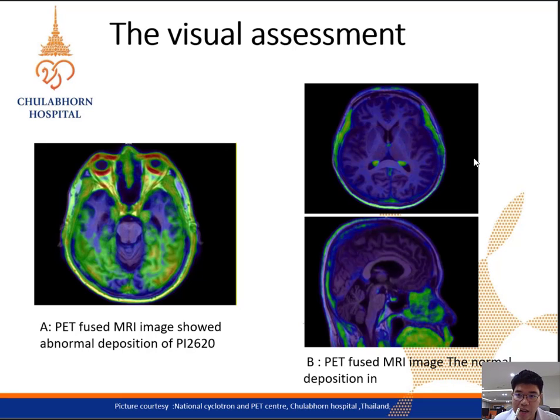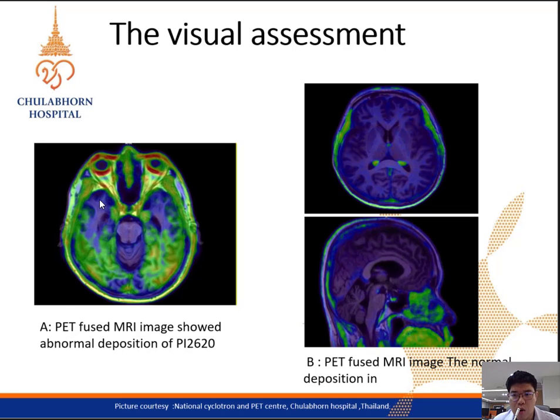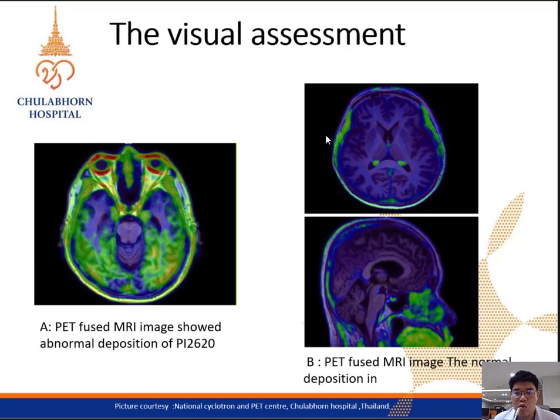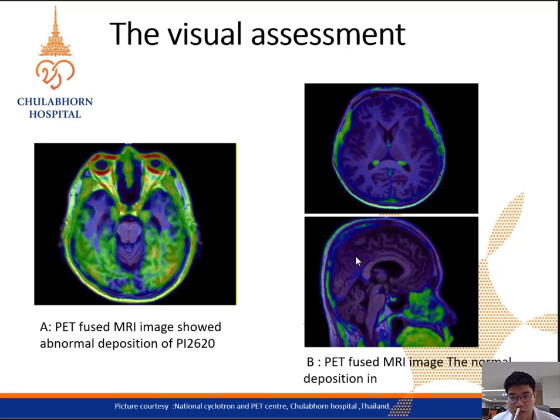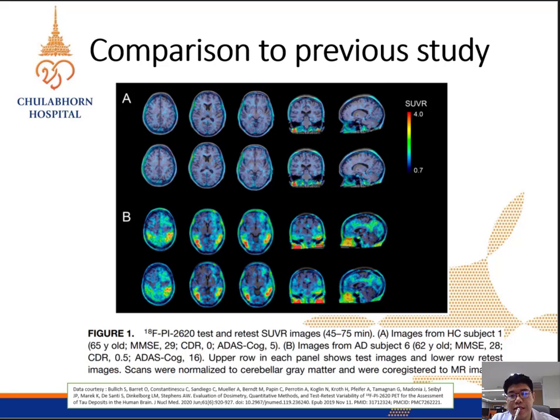The graph shows the overall picture of SUVR values. All observed regions for the MCI and CN groups are below 1.2. In the AD group, the SUVR in significant brain regions is higher than 1.2. The lowest value remains at the cerebellum across all subject groups. We also interpreted the results in correlation to visual analysis: in the CN group fusion images, there is no uptake of PI2620 in the bilateral striatum, thalamus, or white matter, and even the whole cortical region is subtle.